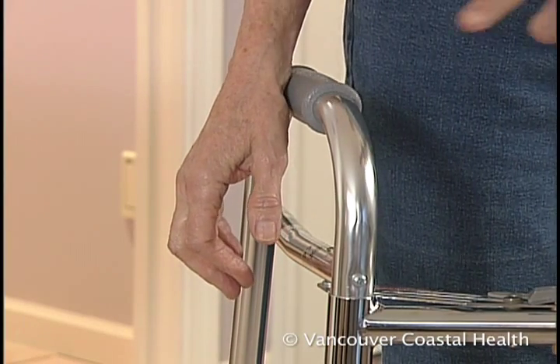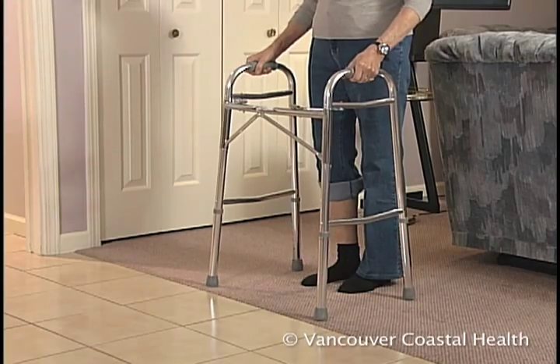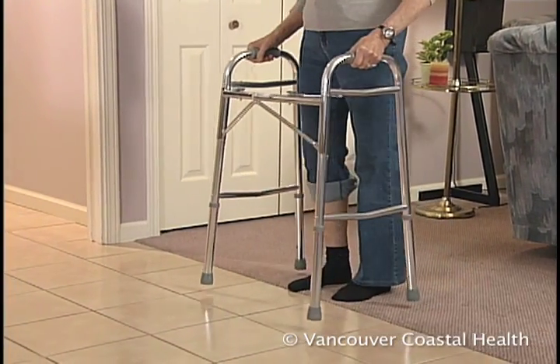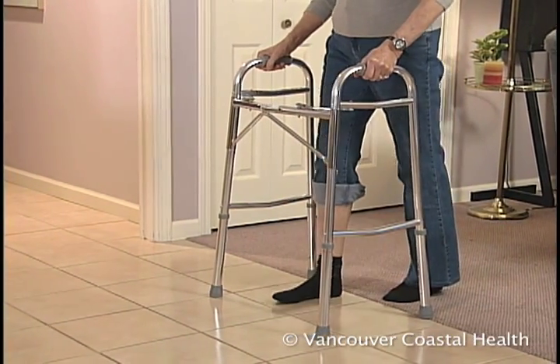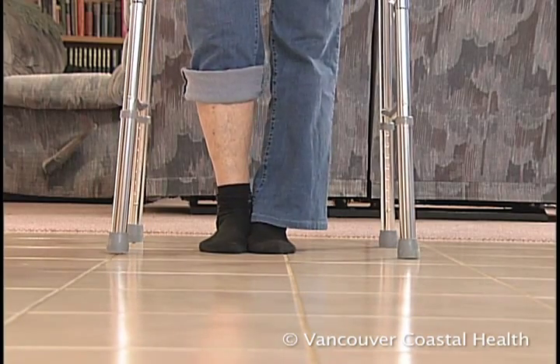Standing with both arms at your side, the walker handle should be at your wrist crease. Place the walker in front of you, press through your arms and step with your surgical leg, followed by your stronger leg. The sequence is: walker, surgical leg, then good leg.